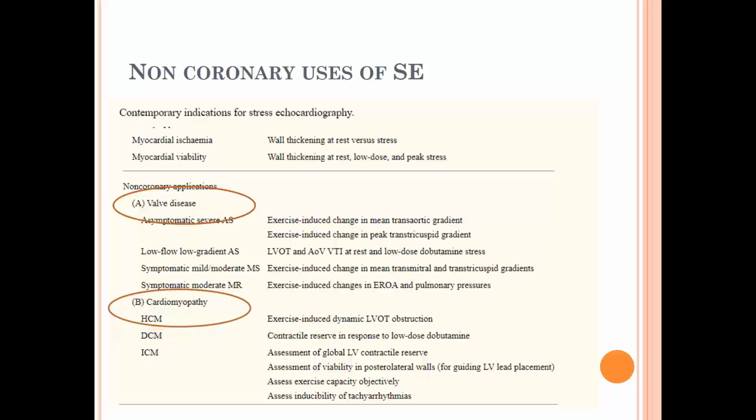Also, the heart muscle disease, it's the same thing. The exercise might induce dynamic left ventricular outflow tract obstruction in cases of HOCM, or we should measure the contractile reserve in response to low dose dobutamine in those with dilated cardiomyopathy. And assessment of viability in ischemic patients.